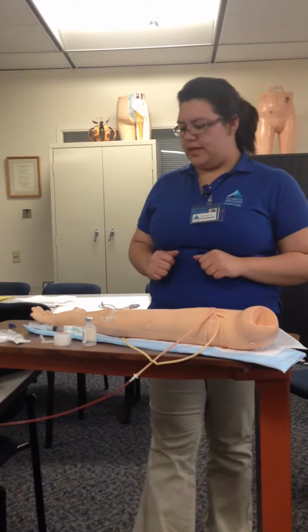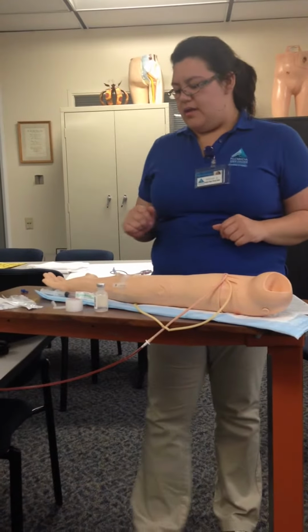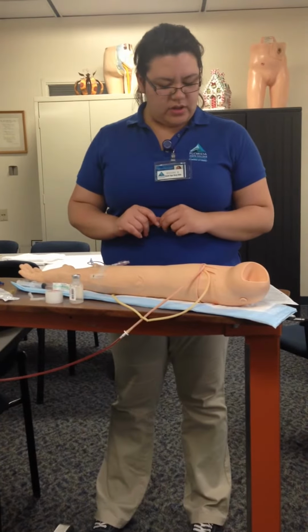And so now I'm going to walk into the room. I have all my items together.